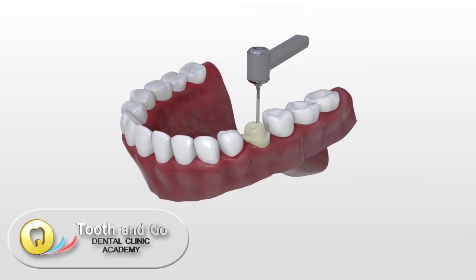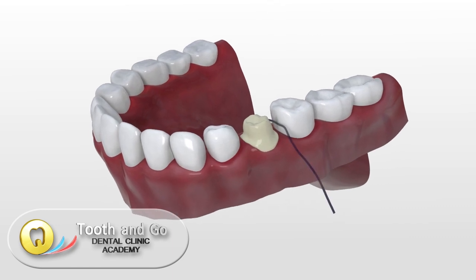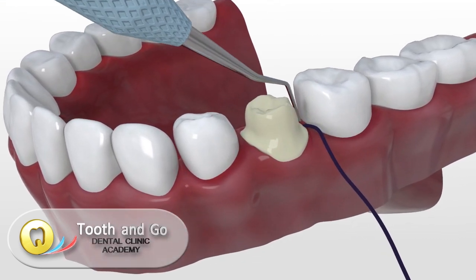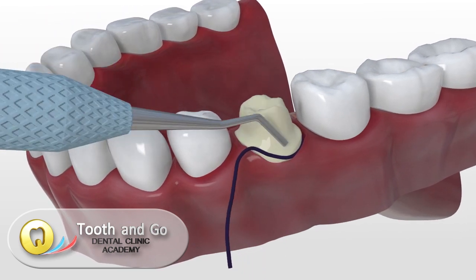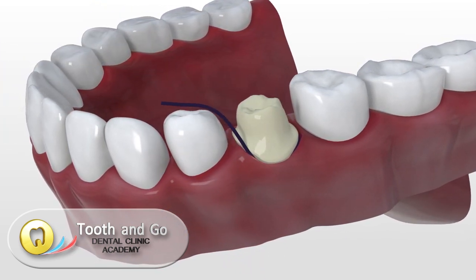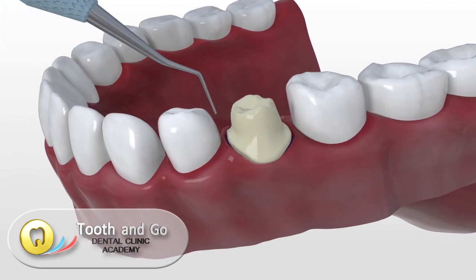The dentist needs to reduce tooth substance to prepare the tooth for a dental crown. The dentist places cords in between the gums and tooth so that the tooth margin is clearly visible in the scan.